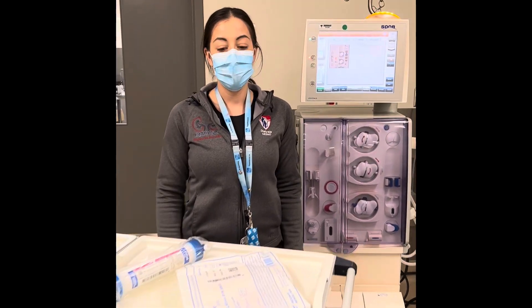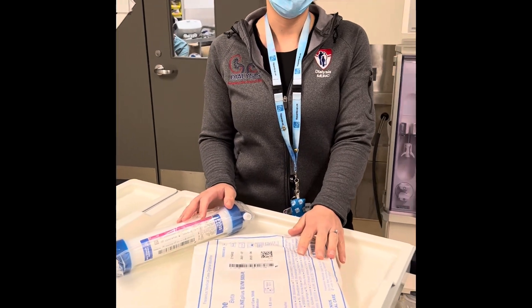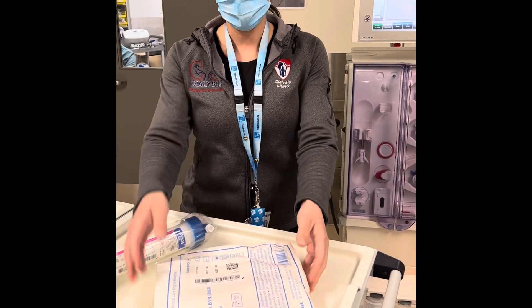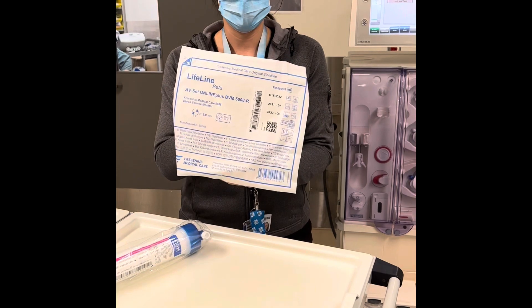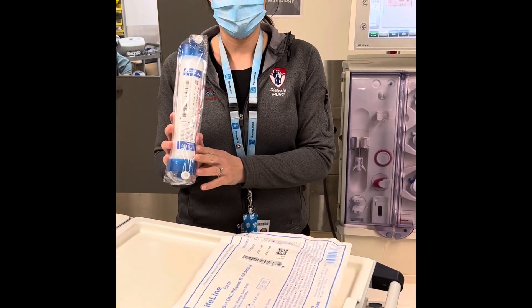Welcome back to our YouTube channel. Today we're going to be going over how to prime your dialysis circuit using online prime. What you're going to need is a Fresenius 5008 dialysis tubing set and your prescribed dialyzer.